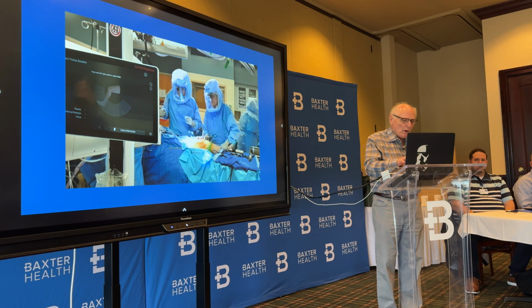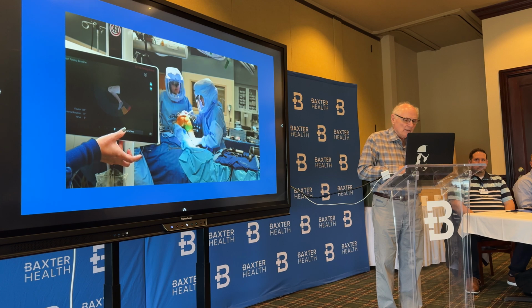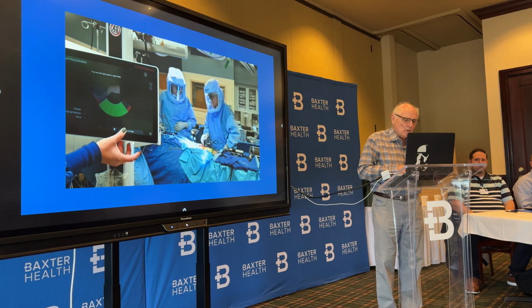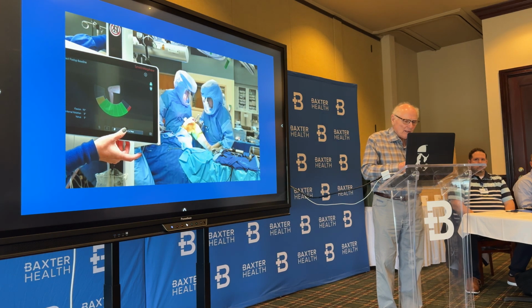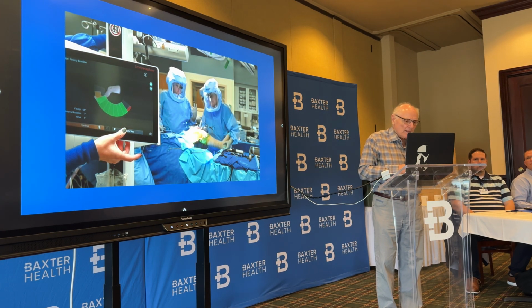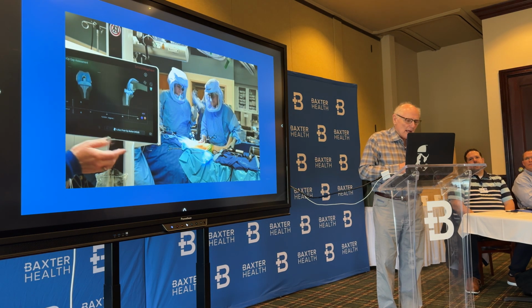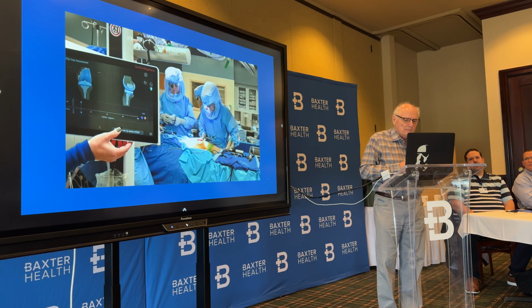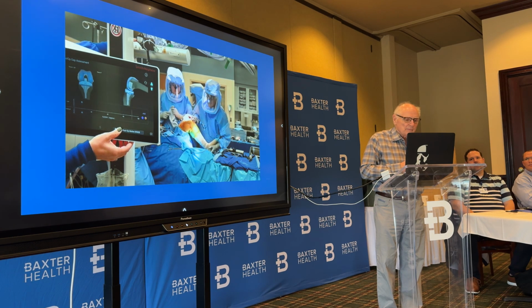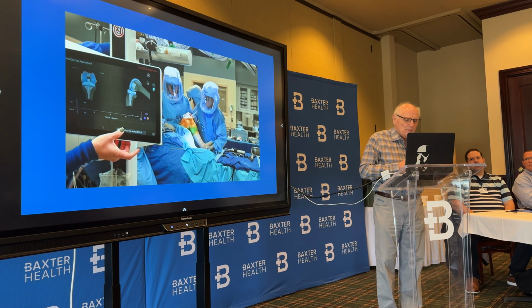At this point in the operation, we have the trial implants in. We're putting them through range of motion. I want you to pay attention to the screen here where we're doing this. It's going to show our soft tissue balance. And then here, we're going to have you just hand stress. Tilt that femoral array up just a little bit, there we go.